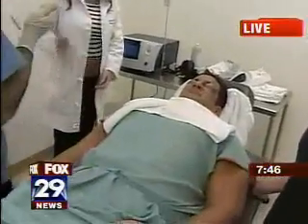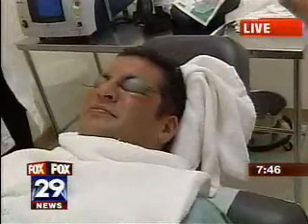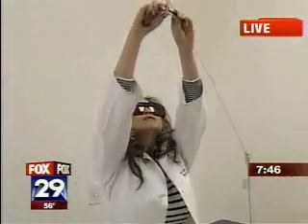Jen is live in Bala Cynwyd this morning with Dr. Mark Solomon. So I guess we're going to see this performed right now? Yes, we are. We're actually prepping our patient, TJ, who's very relaxed, and his eyes look a little bit puffy right in this area because they've put a lot of numbing cream and Novocaine, things of that nature.